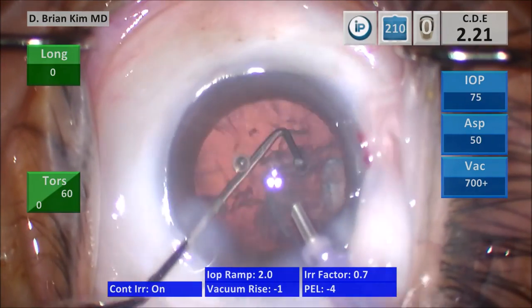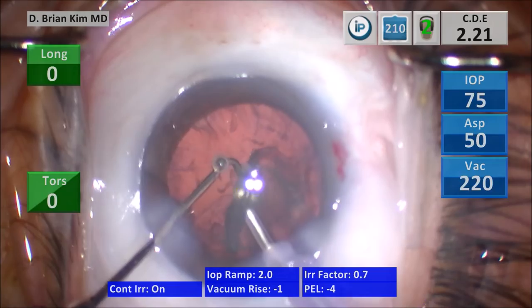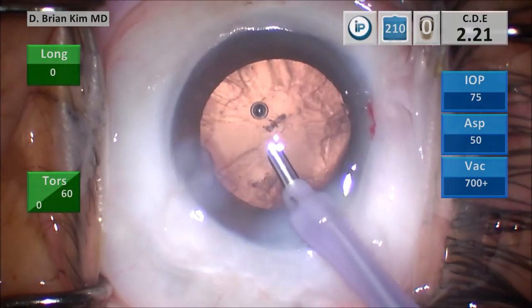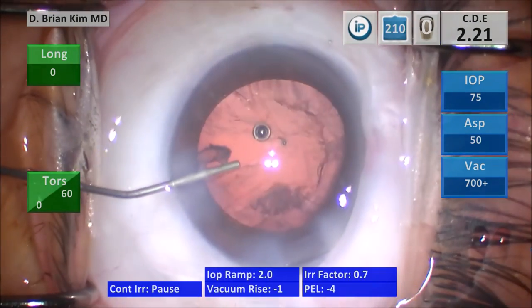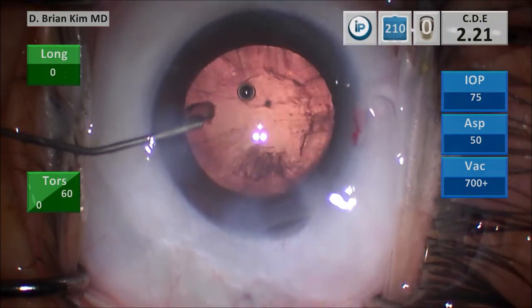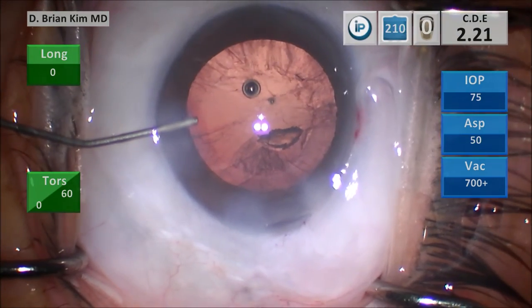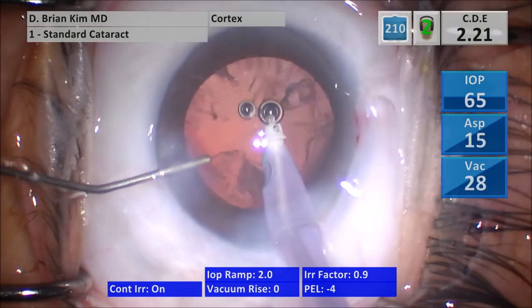Why should you adopt this technique and why did I develop it? I developed double chop and cross chop because I noticed limitations with the techniques I was doing and learned — divide and conquer, stop and chop, horizontal chop, vertical chop. A lot of these techniques are dependent upon the phaco; you have to sculpt, you have to hold and grab the lens. There are a lot of phaco-dependent steps with those techniques.